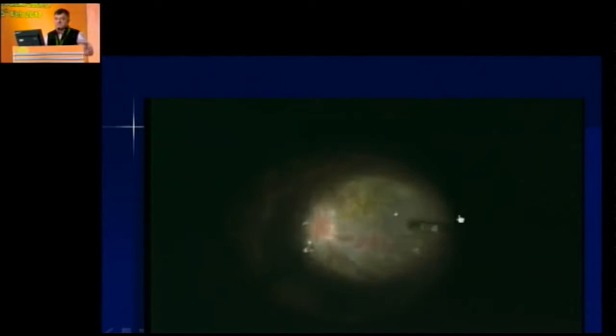The lens also had a posterior subcapsular cataract, and this is the giant tear, which was so stiff, it was standing like a stiff retina there. But despite all this, you can see now the retina has fairly gone back, and keep on removing as much as you can without doing damage. That is very important. If you can keep on removing some of these folds or these epiretinal membranes which are sticky there, then you do the laser. In such a situation, you would laser all around because you have done such extensive surgery and there's PVR.